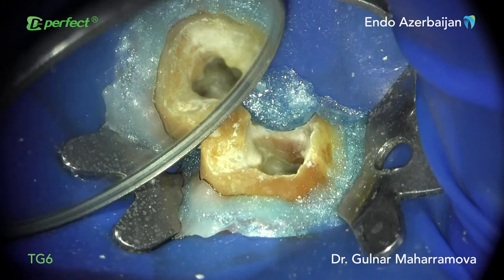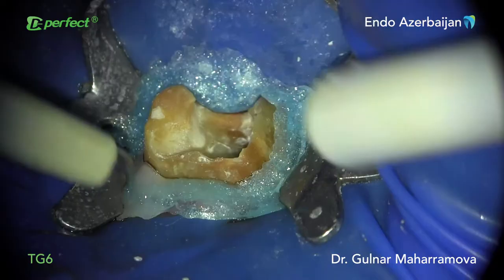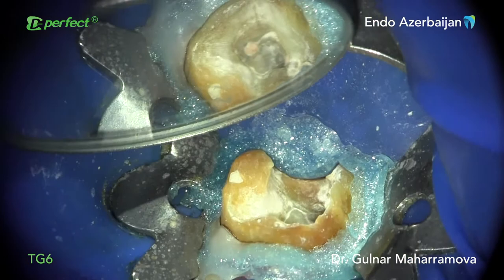After the irrigation, the canal space was dried and the sealer was placed. According to the irregularities and complexity of the root canal space in this specific case, I used injection of warm gutta percha to get a better sealing and obturation. Finally, when the access cavity is cleaned from excess gutta percha and sealer, the patient can proceed with the restoration.